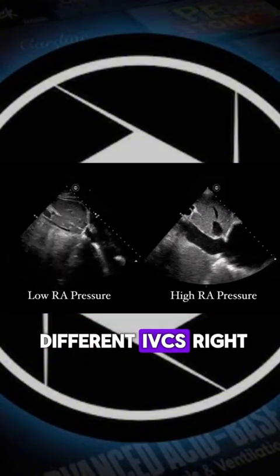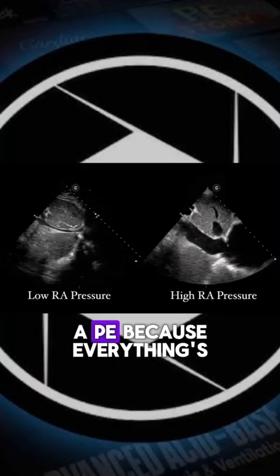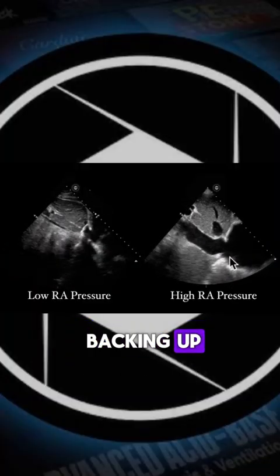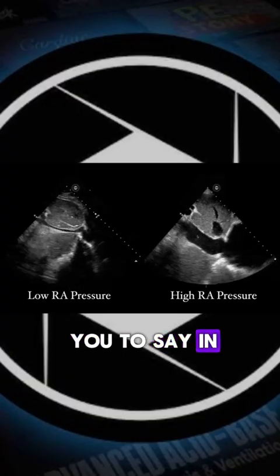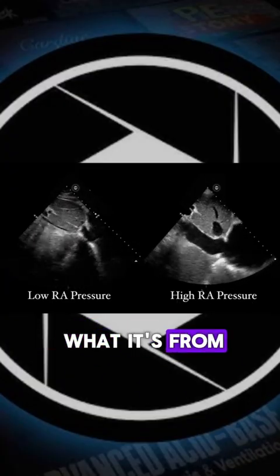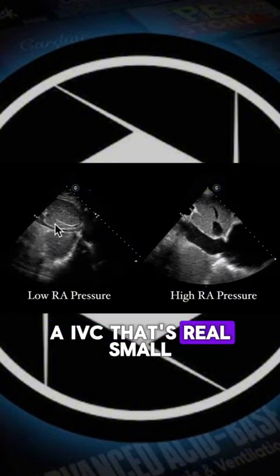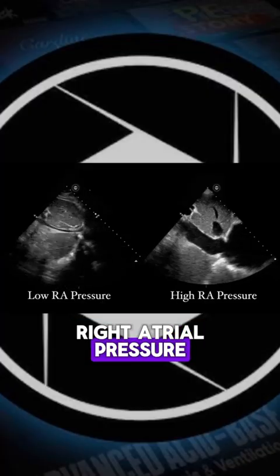Now, these are two different IVCs, right? So this is probably the one that we would see in a patient with a PE, because everything's backing up. And if you see this, I just want you to say in your head, they have a high right atrial pressure. Don't try to assume what it's from. And then same with this. If you see an IVC that's real small, they have a low right atrial pressure.